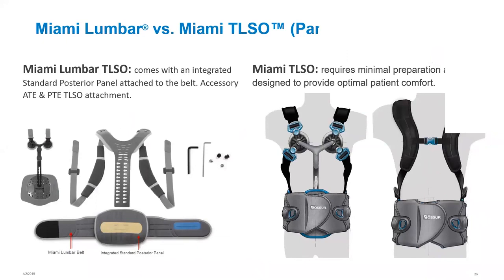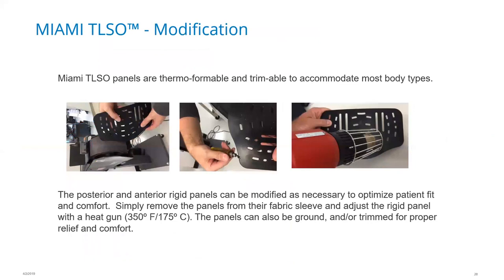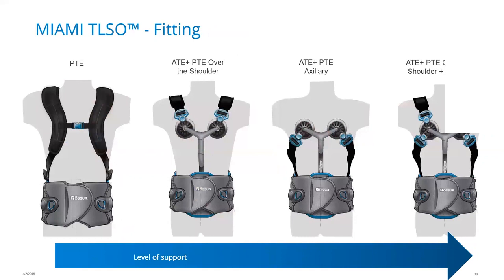Okay, when comparing this to the original Miami lumbar TLSO, there's a lot of streamlining to this. We've made it quicker, faster, and much simpler for you as a clinician to fit, and it requires minimal preparation whilst optimizing the patient's comfort. The panels themselves have a similar configuration, and you can see these are anatomically sized from a waist circumference in order to give you your size, and there's a big relief down the center to avoid putting pressure on the spinous processes, but it provides some pressure on the paraspinal muscles in order to maintain it in position. This can also be modified, so the panels can be removed, and then using a heat gun, you can heat mold these. Equally, you can adjust the shape, and these can be ground or trimmed for proper relief or comfort. So I'm just going to go on to a fitting now.